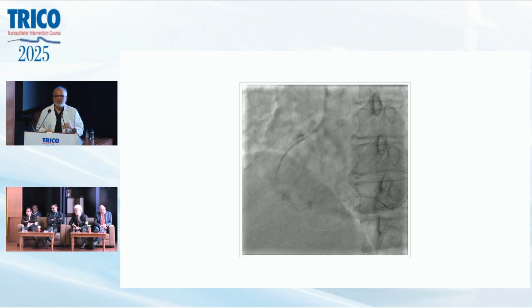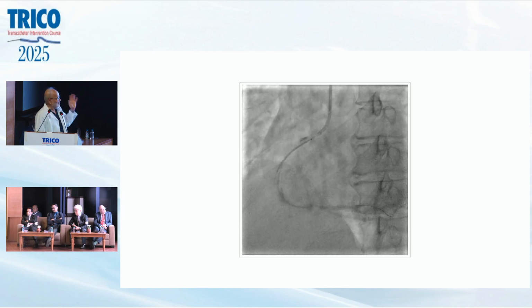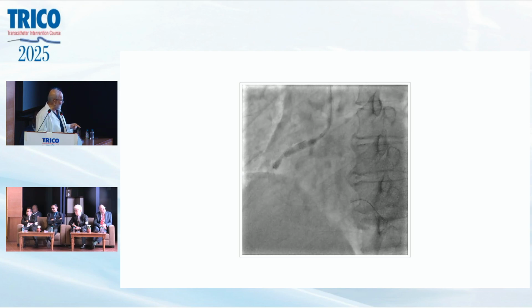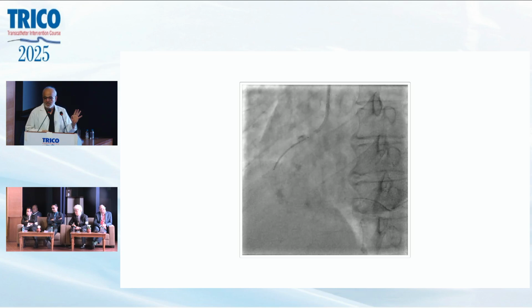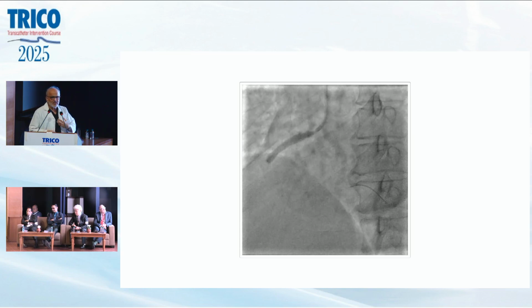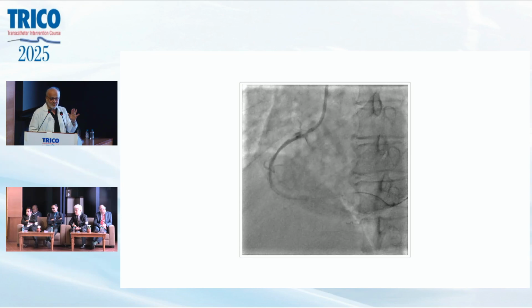The strategy completely changes. Instead of dilating the culprit and finishing PAMI within a short time, now the thing is to prevent ascending aortic dissection, because this RCA dissection going like this can extend proximally, and it can go right up to the innominate artery, and then you are in trouble. So first and foremost, once your wire is in the true channel, this is our strategy. We have done this type of complication 3-4 times, and every time the patient has survived with a good result.